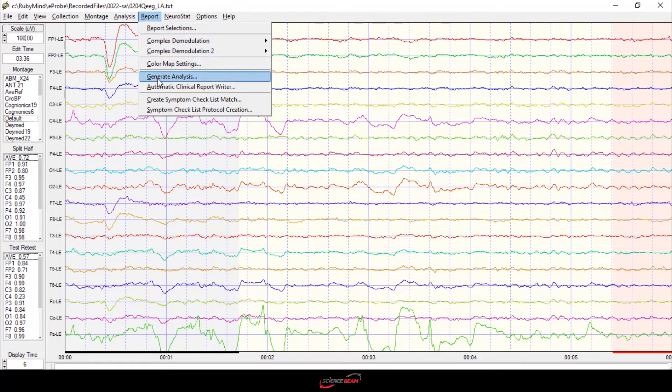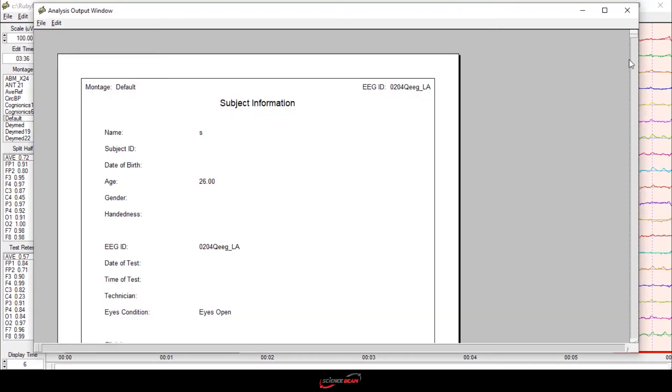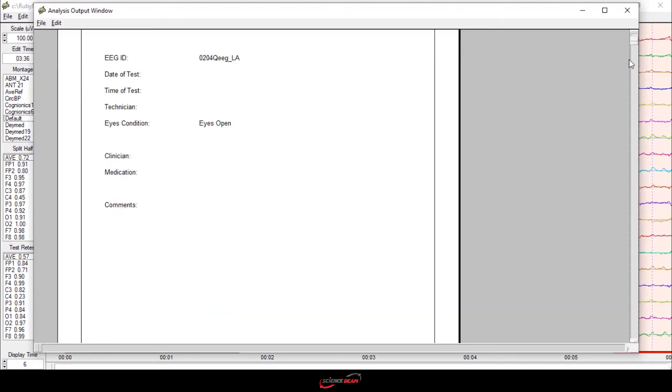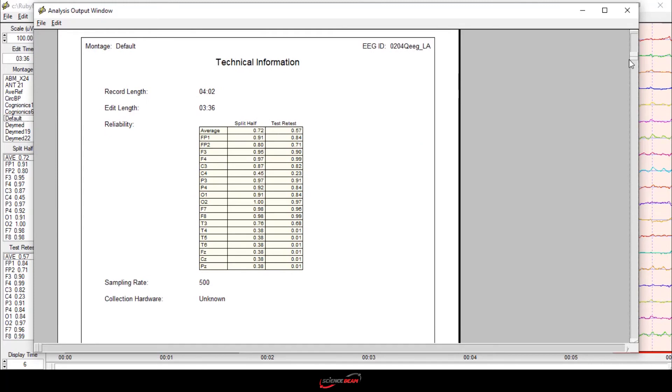After recording EEG signals, in order to improve your clinical service, you can use NeuroGuide software, which is an informative and comprehensive digital EEG and QEEG analysis system that enables you to obtain a reliable, fast and efficient automatic clinical report.